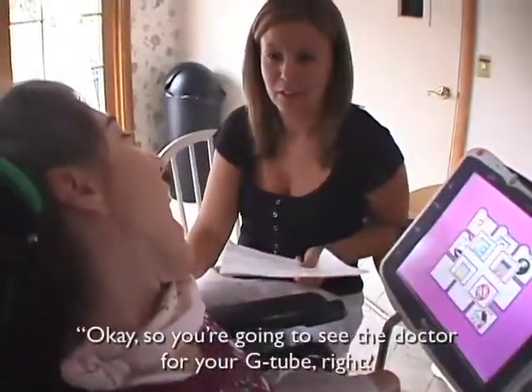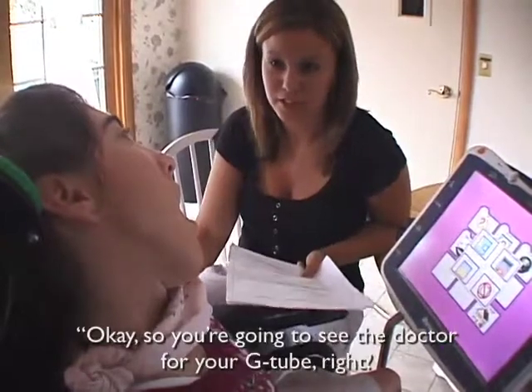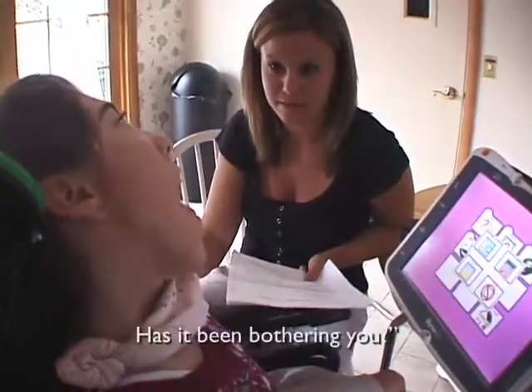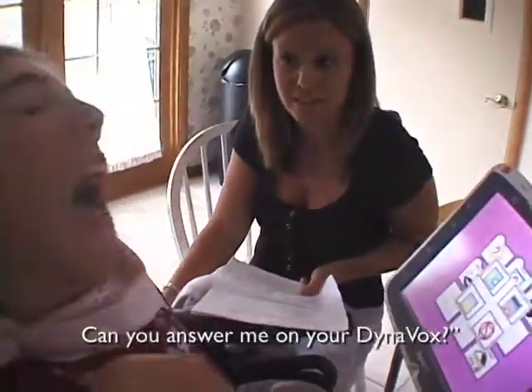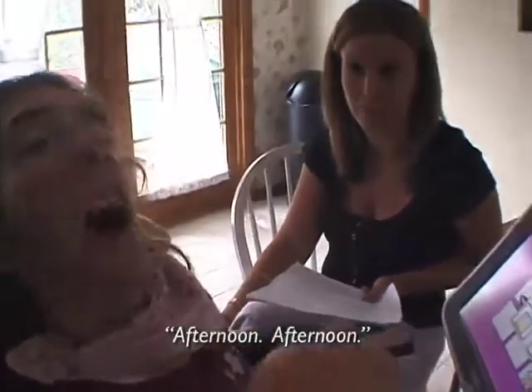Okay, so you're going to see the doctor for your G-tube, right? Has it been bothering you? Okay, when has it been bothering you? Can you answer me on your Dynavox? Afternoon. In the afternoon? Okay.